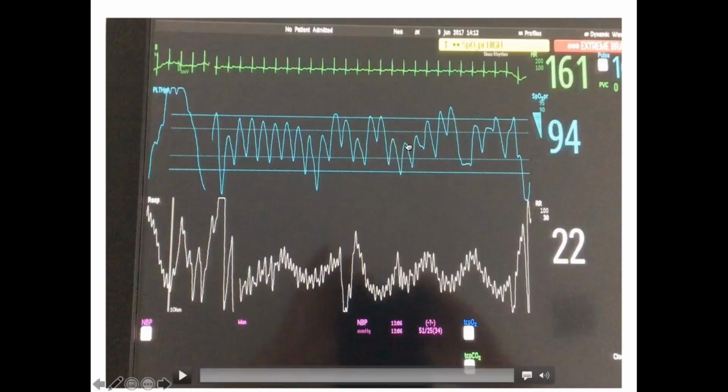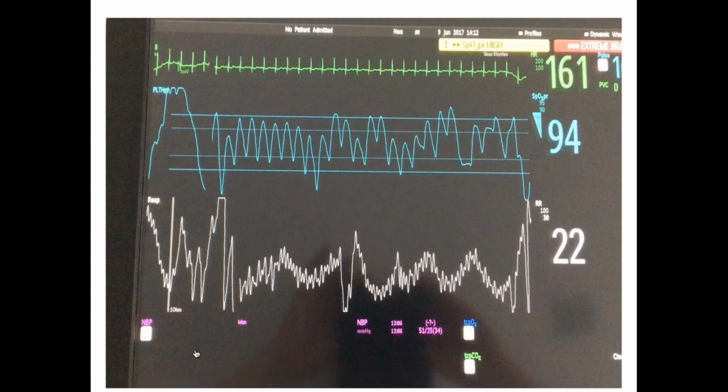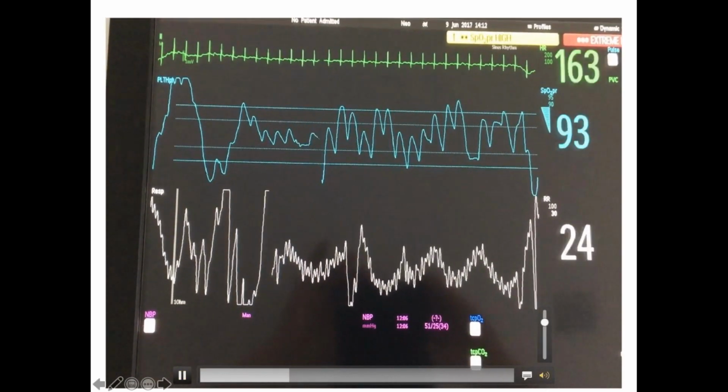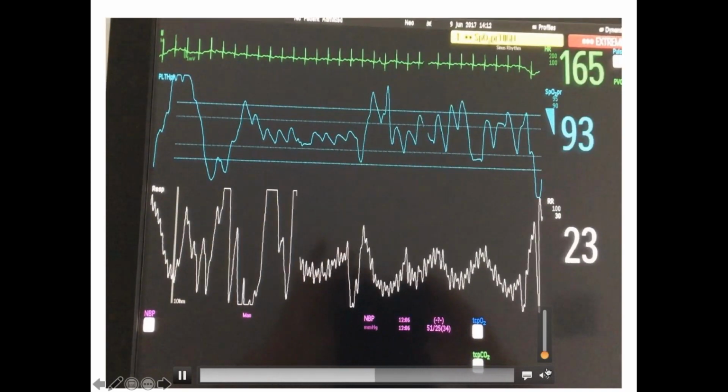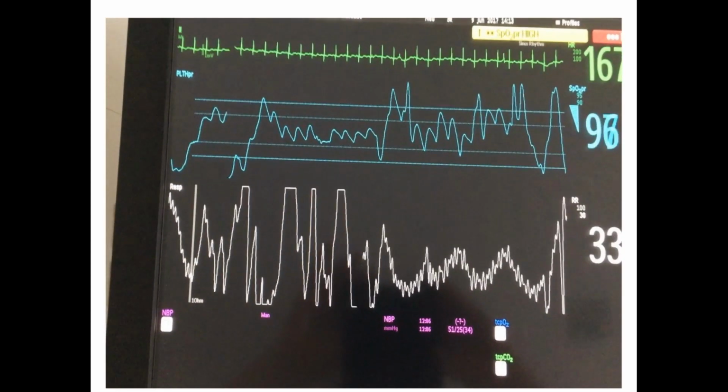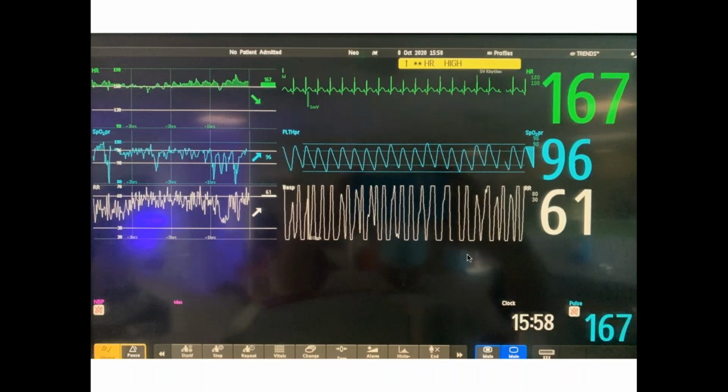So on your units, I don't know what sort of monitors you have, but you may be going around on a ward round. And I can certainly remember in the previous era, we would just really basically have a screen up, which would give you in real time, as I might be able to show you here, just a 10-second clip of what's happening on the unit. And this is just a snapshot, and it's not really giving you much information at all in terms of the stability or otherwise of your patients. You may prefer a system where you've got that real-time monitor and a trend value displayed, as in this case for the preceding 4 hours. And you can see here the saturations are dipping a little bit.